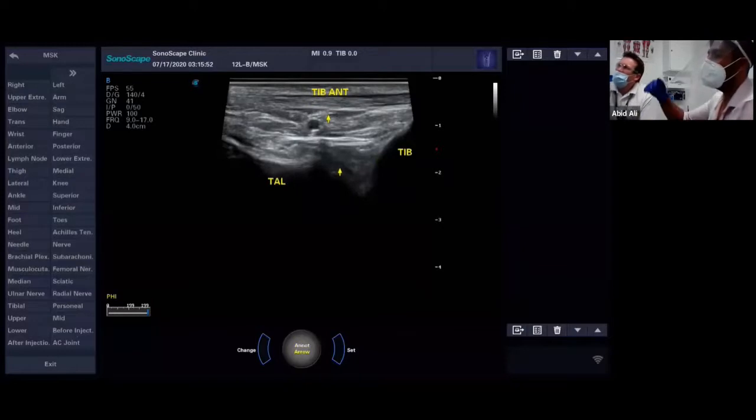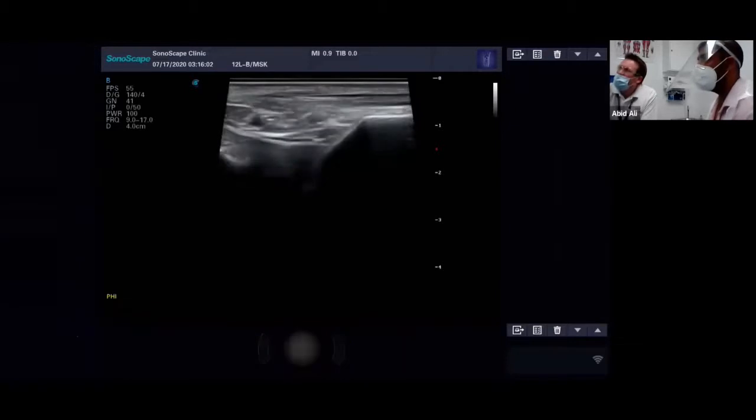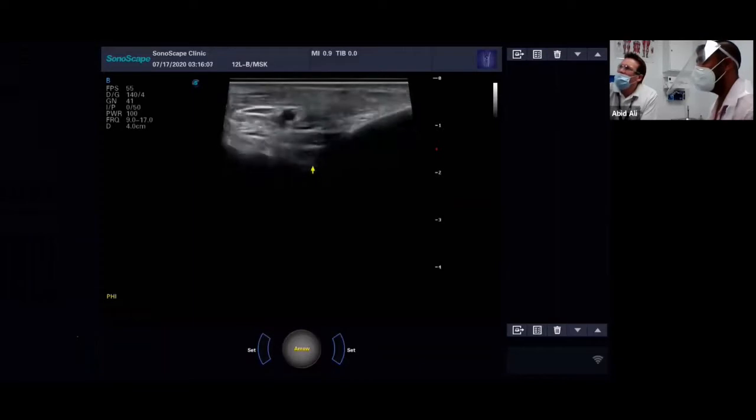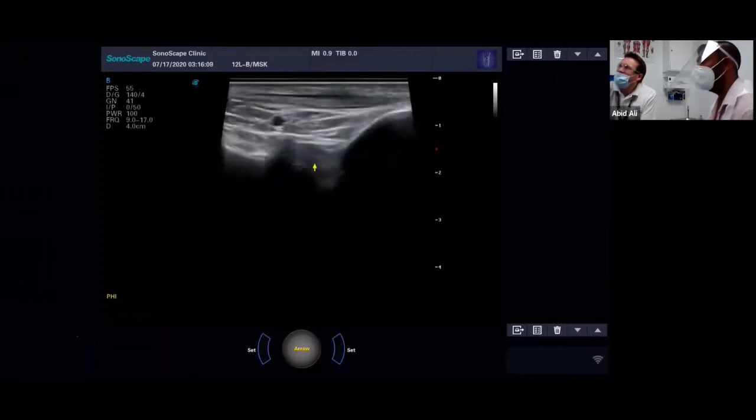So don't forget, we're looking down through the layers. So you're looking at the ankle mortise in between the two bones. So this area here is tissue, but no bone. Your talus is a bit deep, isn't it? Yeah, he's got a deep talus, guys.